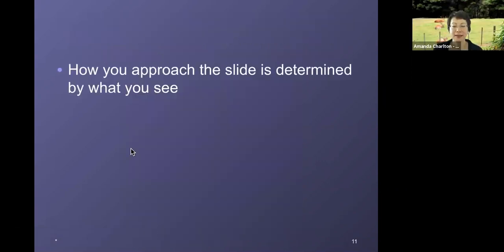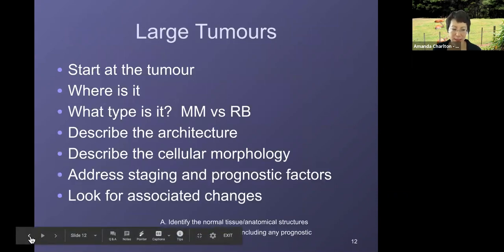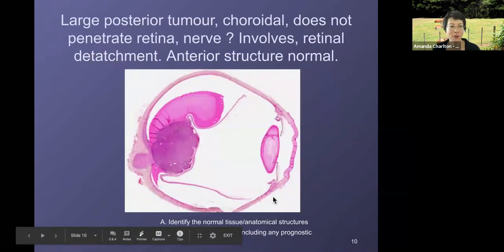Diane, for that slide, I'm looking at the cornea. It looks a bit funny to me. Why isn't it smooth and dome shaped like a normal cornea?